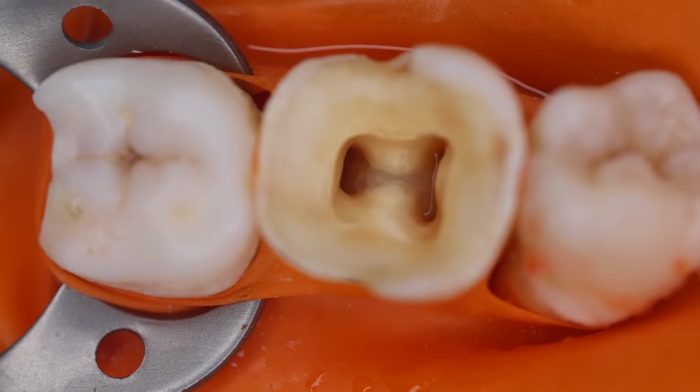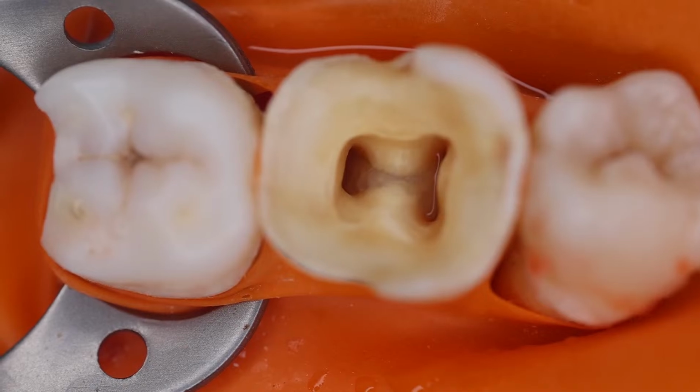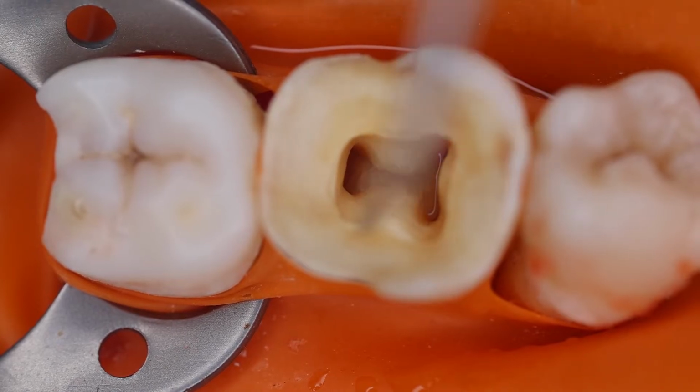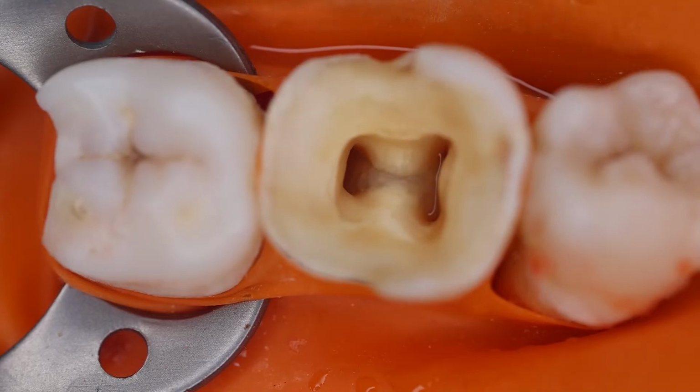Now the working length has been determined, and the next step is the initial canal preparation followed by rotary endodontics. We would be back in the next session where we would see how to do the chemomechanical or biomechanical preparation, or more precisely the cleaning and shaping of these canals, to seal them appropriately.